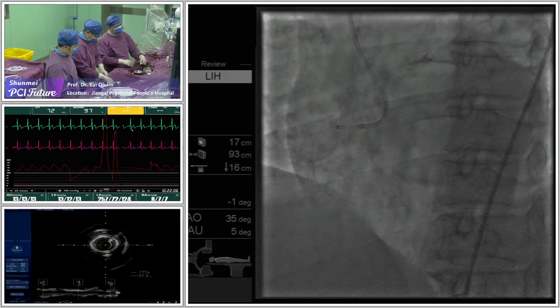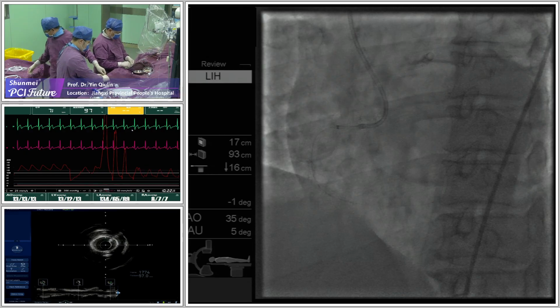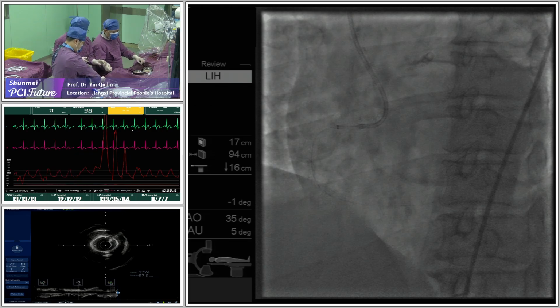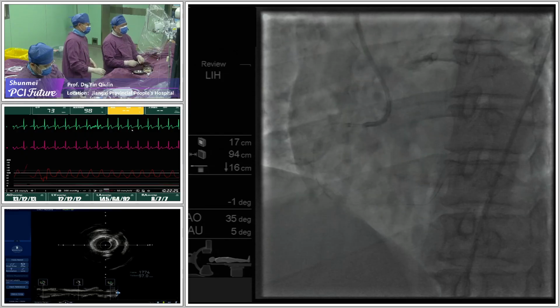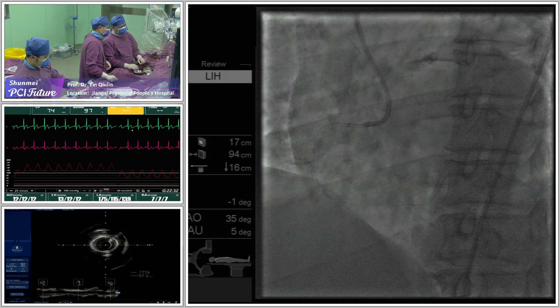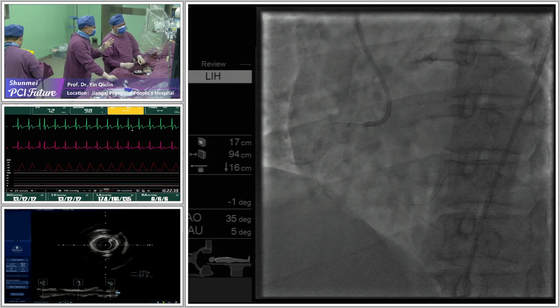Some bubble. We can see some hematoma, but this hematoma is limited to just around the septal intima. 有2个吗？One is in the plaque. The other one is retrograde RG3. So the wire 拿过这个弯就可以。It is in the plaque all the time.